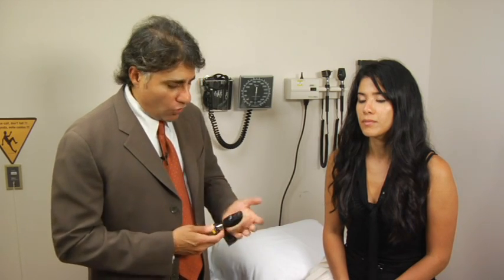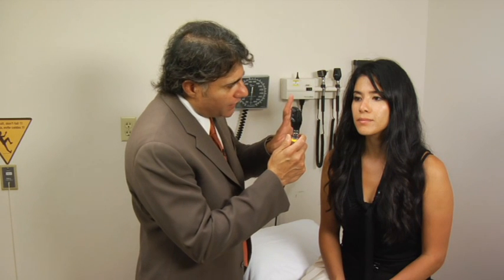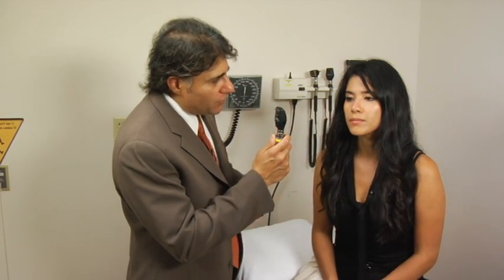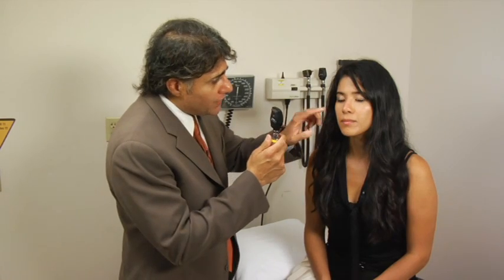Once I've examined the ocular adnexa, the next step is to look at the anterior part of the eyeball itself. And that's done best with either a pen light, again a very bright light source, or as I have here, a direct ophthalmoscope, which is very handy. So what I'd like to do is have Dr. Zhao look straight ahead, and I'll shine a light into the eye, and the first thing that I like to inspect is the conjunctiva, or the white of the eye. And I'm looking to see if there is any injection, if there's possibly any hemorrhage, if there's any discharge coming from the conjunctiva.